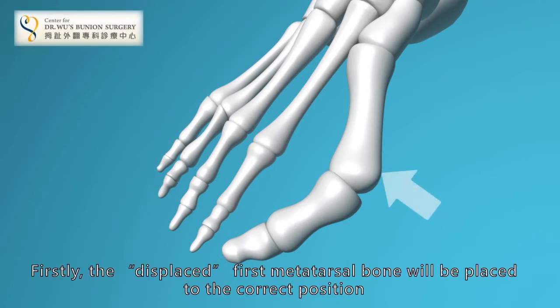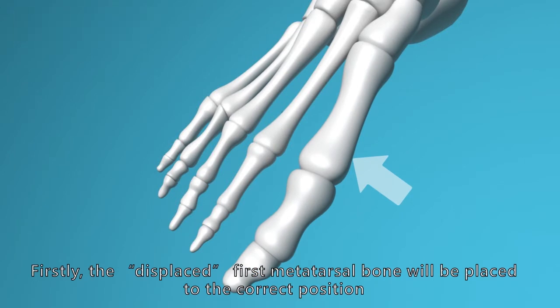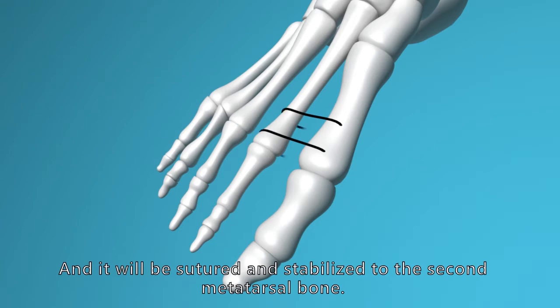Firstly, the displaced first metatarsal bone will be placed to the correct position, and it will be sutured and stabilized to the second metatarsal bone.